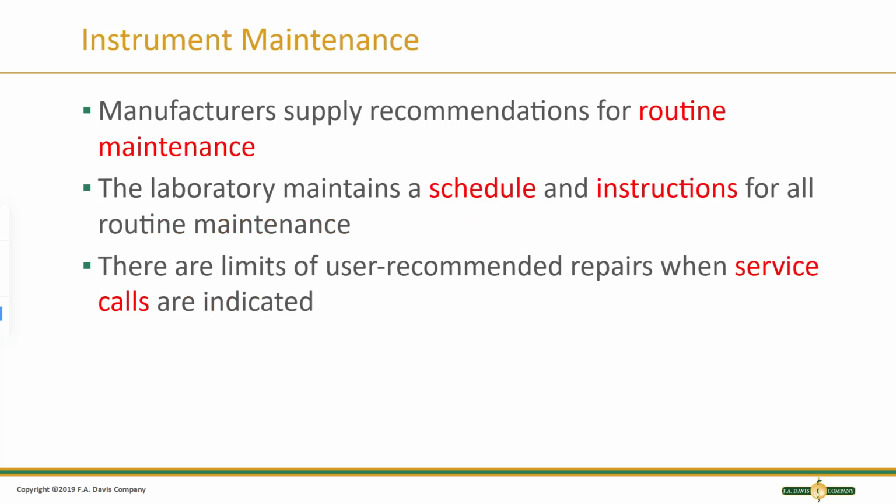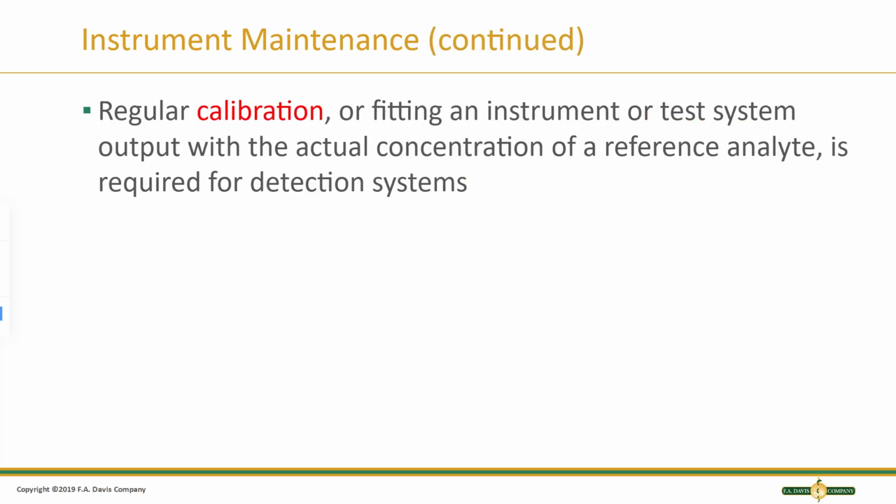Manufacturers supply recommendations for routine maintenance. The laboratory maintains a schedule and instructions for all routine maintenance. There are limits of user-recommended repairs when service calls are indicated. Regular calibration, or fitting an instrument or test system output with the actual concentration of a reference analyte, is required for detection systems.